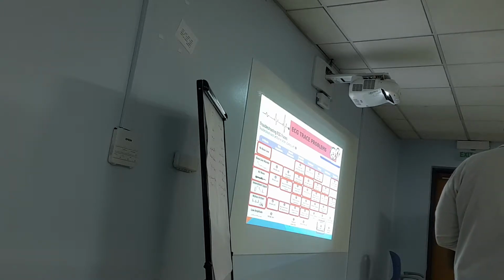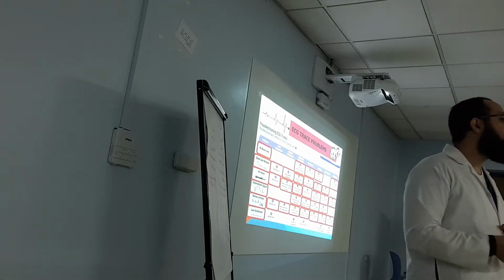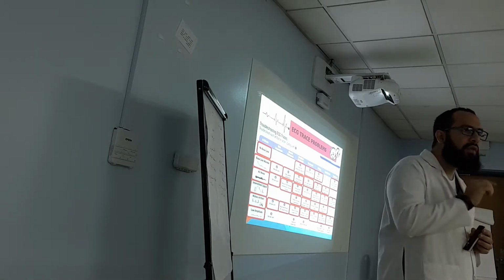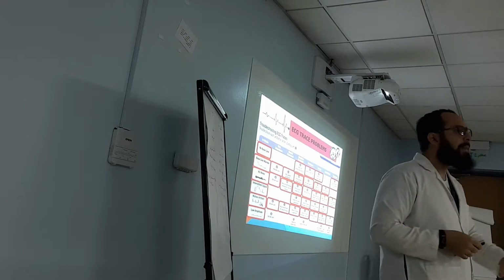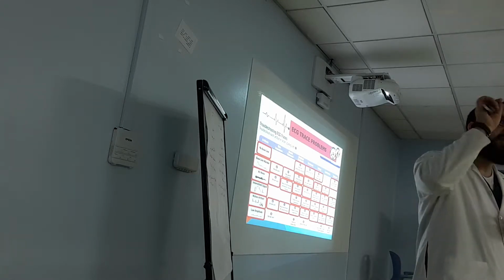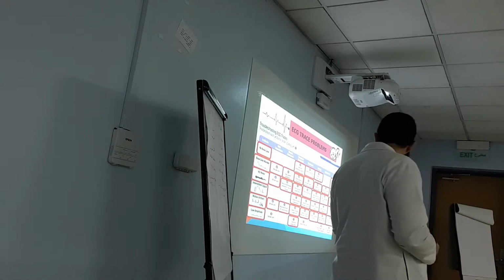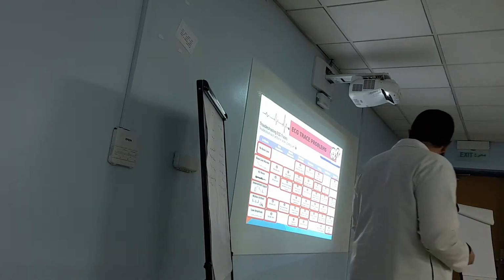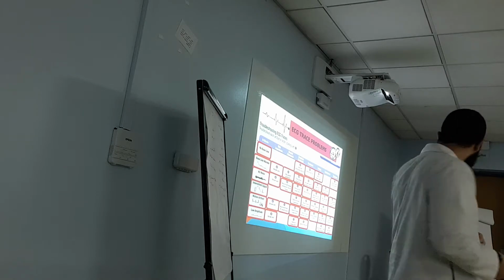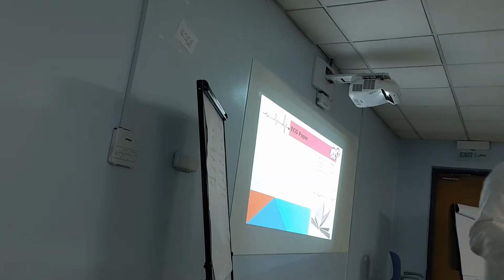And also, if you have low amplitude, if you see the waves are very tiny, probably it's your settings. There is something called gain. It gives more sensitivity for the ECG waves. If it's tapered down, your sensitivity for ECG is less, so it sees the normal ECG as very tiny. So you adjust the machine setting, we will talk about that. Check the connection, check the gain setting, and other electronic devices can affect the amplitude. So now you prepare everything, connect the leads, prepare the machine.